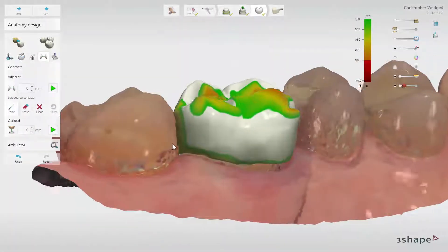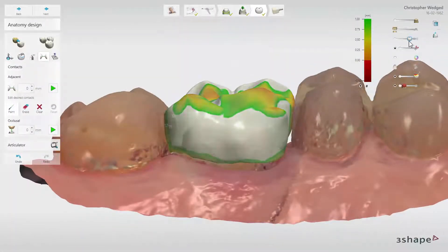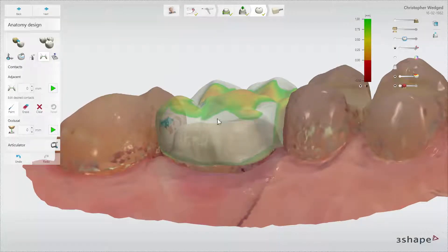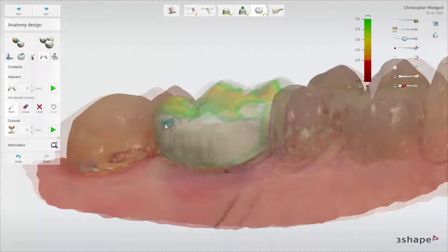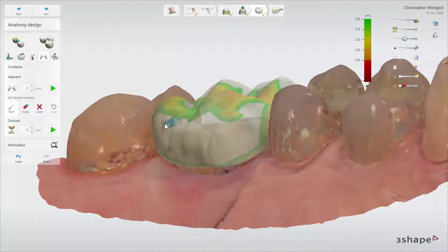It is also possible to adjust the shape of the contact areas. The blue marks on the scan indicate the contact area that the software will adjust the design to. These are calculated automatically. Then use Paint to add to the contact area shape. The radius of the Paint tool can be modified — click Shift and scroll the mouse wheel to do that.